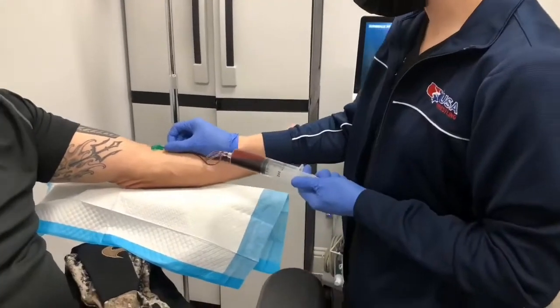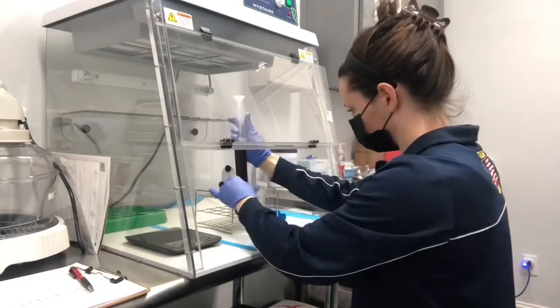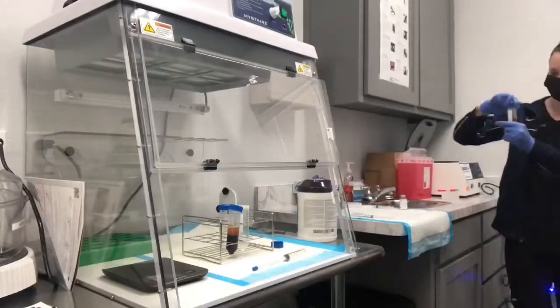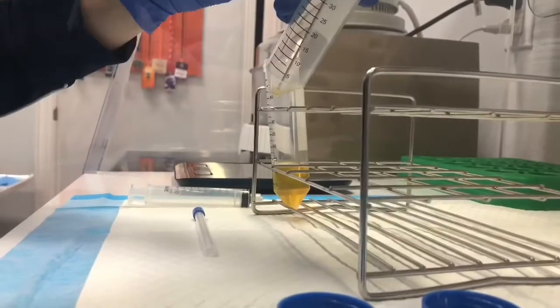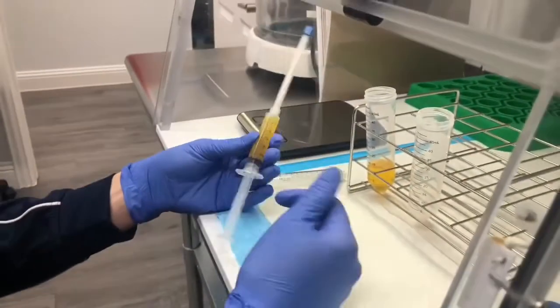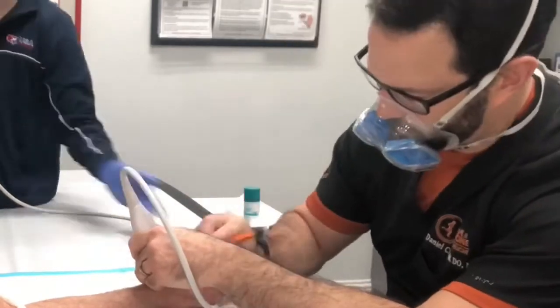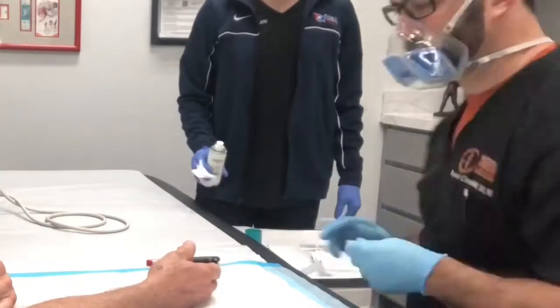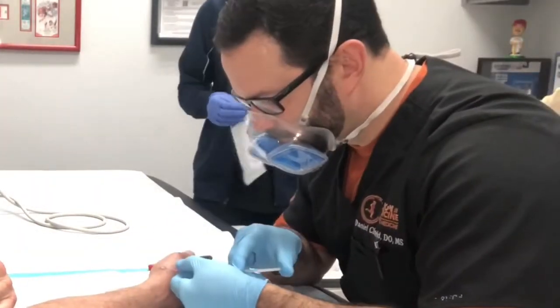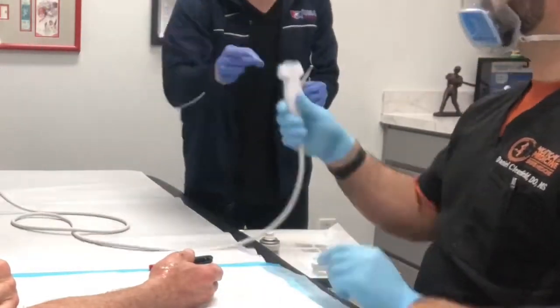Stay tuned to see the process of how we make PRP. First we take out a small amount of blood from your arm. After that we process it under our sterile hood and then place it inside our centrifuge, concentrating it down to get the PRP — which you can see is this nice yellow product. Once we have it ready, I'm going to go ahead and take my ultrasound to mark up the areas that we're going to be injecting. Then I get it cleaned up, numbed up, and then once again locate it before we get it injected with the PRP.